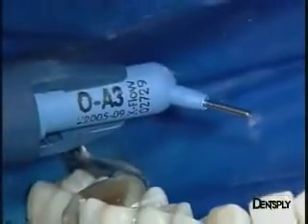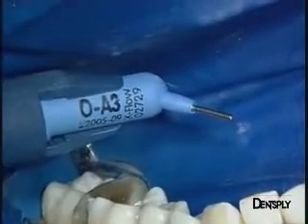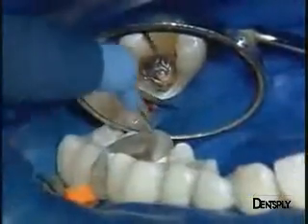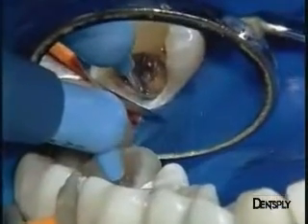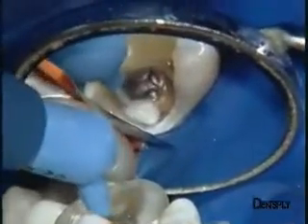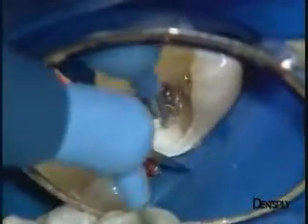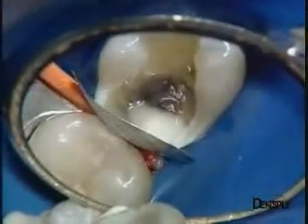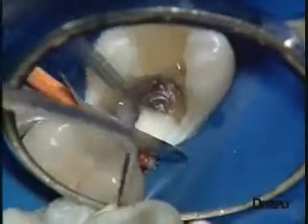The first layer of the Universal Flowable Restorative X-Flow of opaque A3 shade is used to mask the brownish reactional dentine at the bottom of the cavity. This first application is properly inserted thanks to the thin cannula at the cervical level and is light cured.